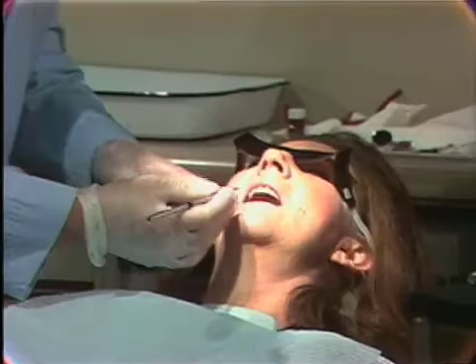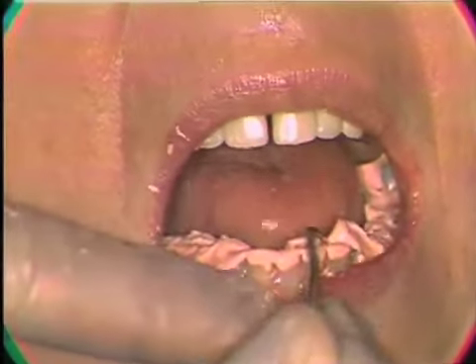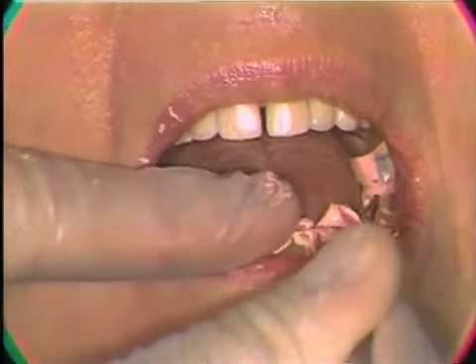Now we would have to free the impression from the teeth, and this would involve chipping away that material that's around the undercuts of the teeth.